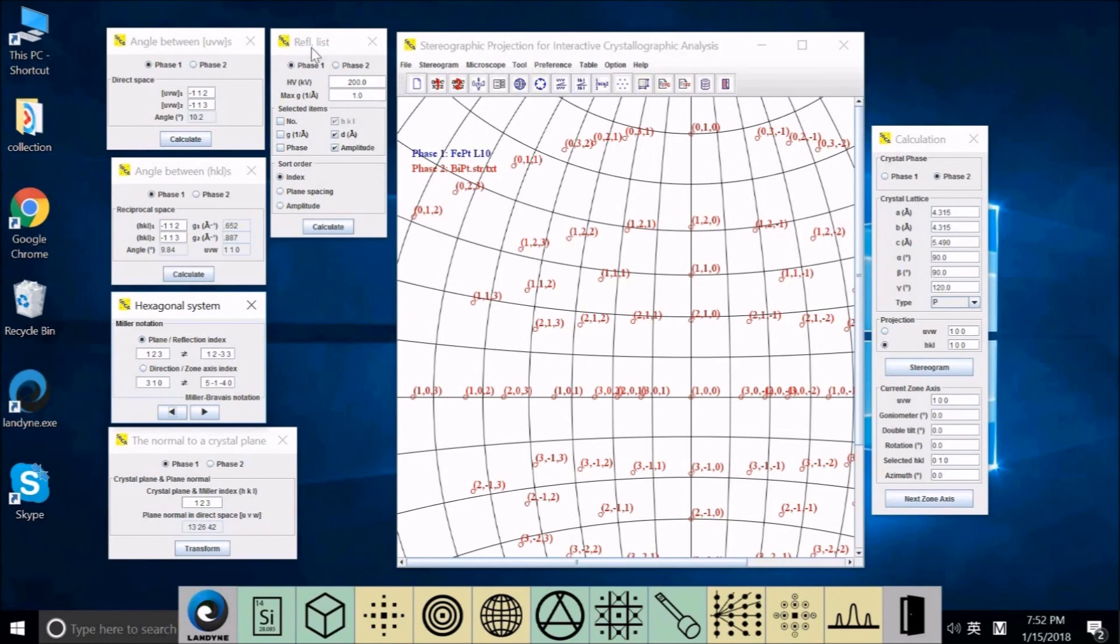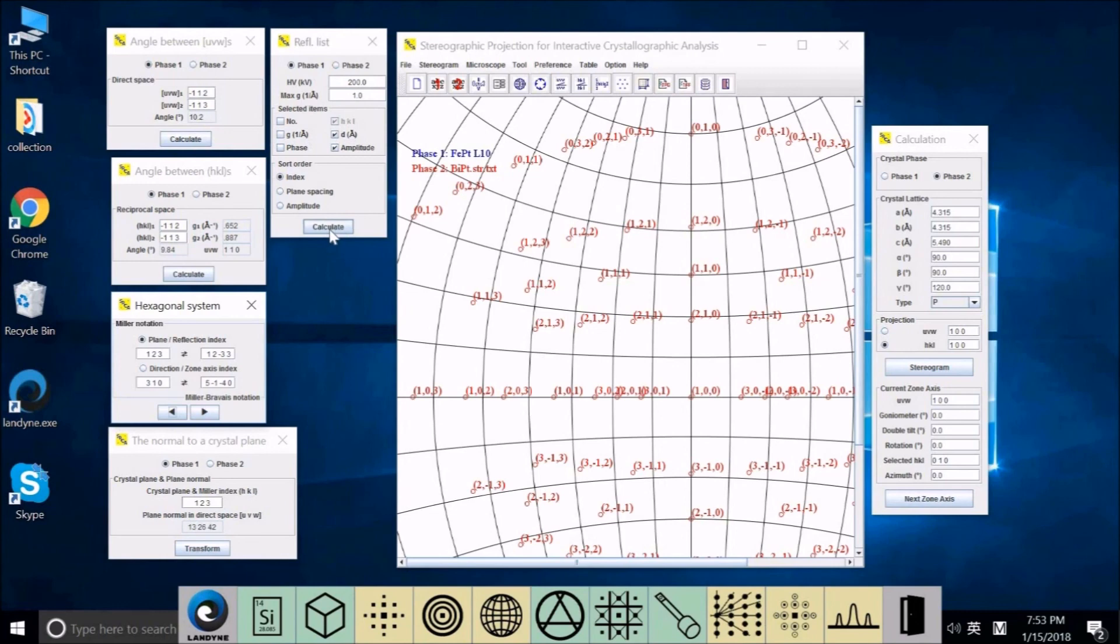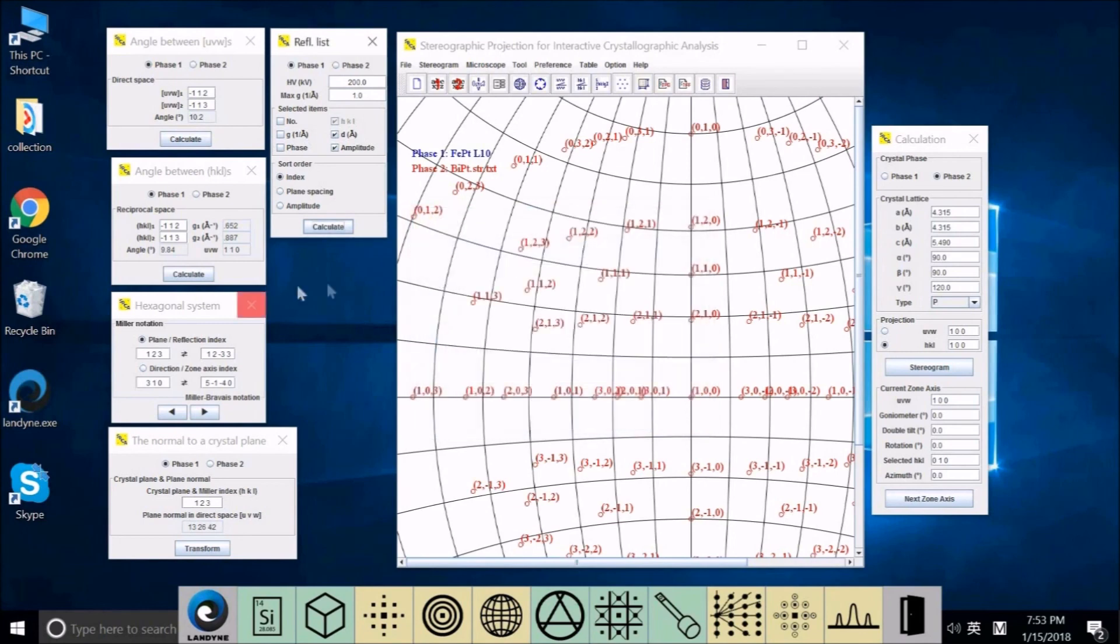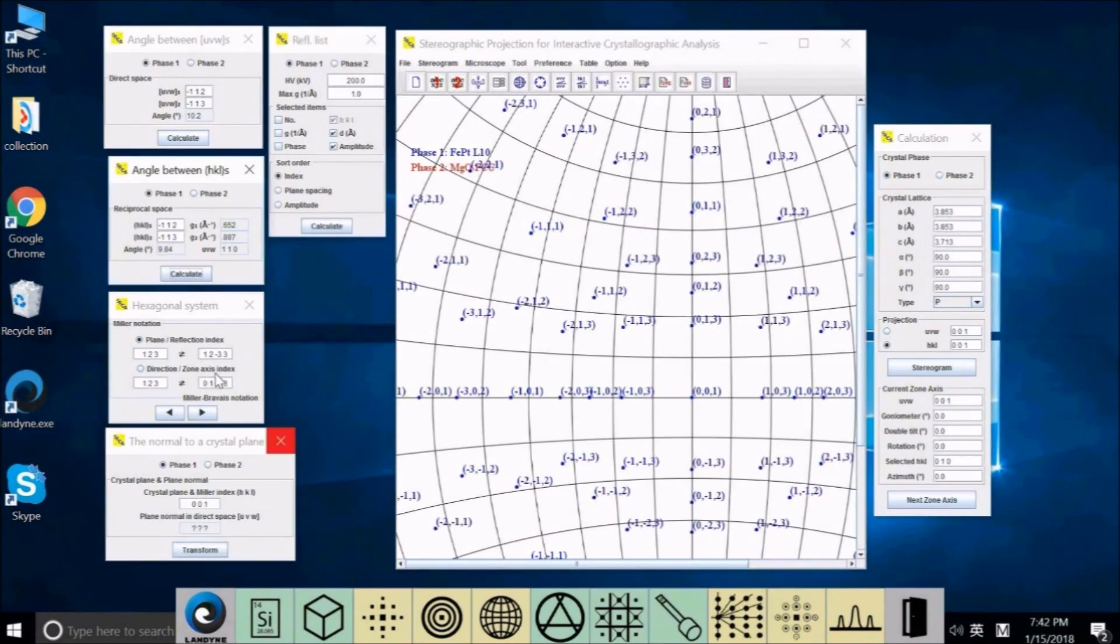The last one is for the diffraction list. We can provide you to calculate it. You first select phase one or phase two. Put the high tension here. And what is the maximum of the G value you want. You can select which column is in your output. You can sort by indices or plane spacing or amplitude. After you calculate, it will save. You can save this result to a table file.